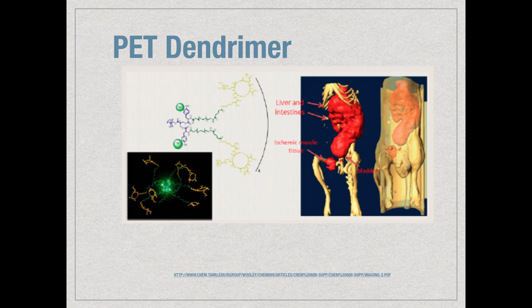But these can track pH, they can track ischemia, that's the oxygen sensing part. They can track perfusion, so you can look at how long it stays in the bloodstream. That can tell you, and you can see with the resolution that you can really tell where these particles are. So it's really sensitive, and it allows you to track where your particles are going.